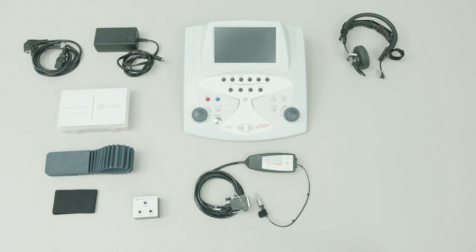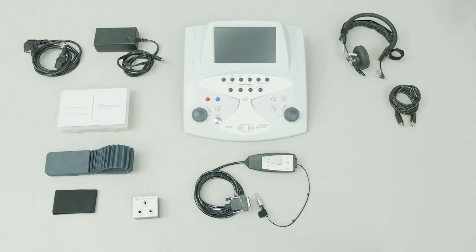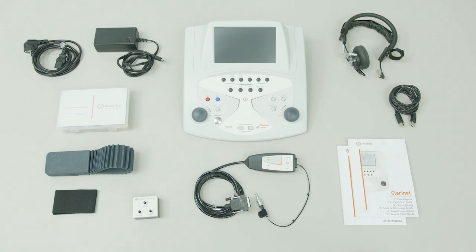The package also includes a medical grade power supply, a USB connection cable, a user manual, a multilingual quick start guide, and the Inventus software suite available on the USB provided.